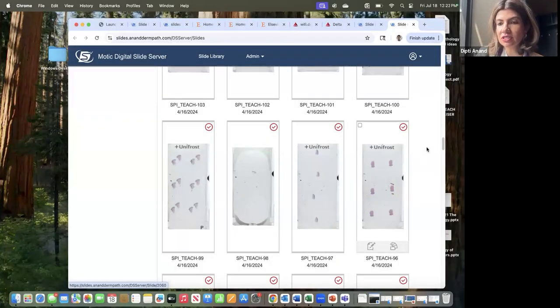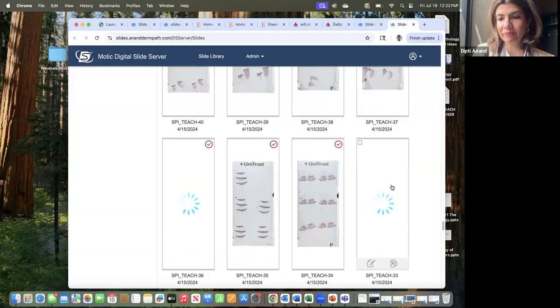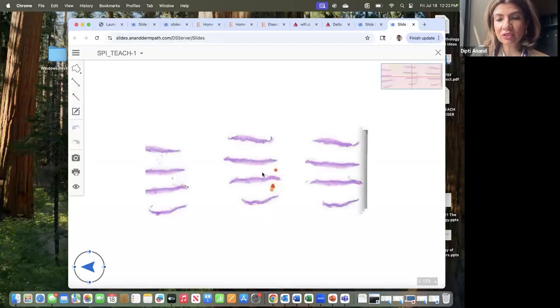Okay. So the spongiotic psoriasiform and interface diseases is what we are going to be starting with. Last week we had the introduction of basic stuff. It's taking a minute to load. Okay. So we did talk about spongiosis and what it really means, and that it is a very common reaction pattern that you guys basically encounter.